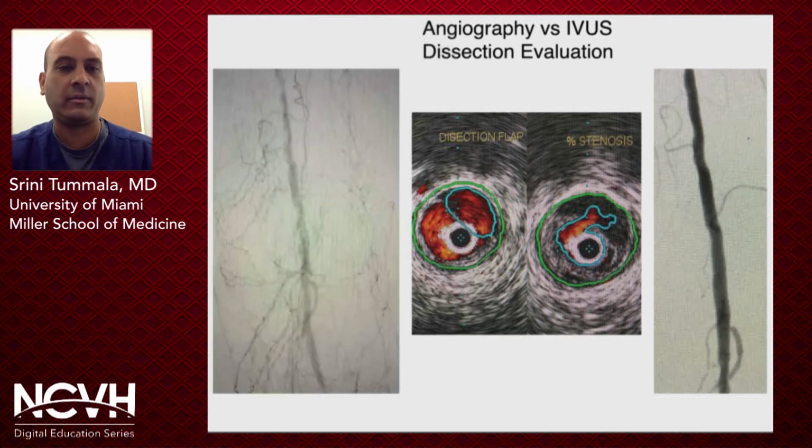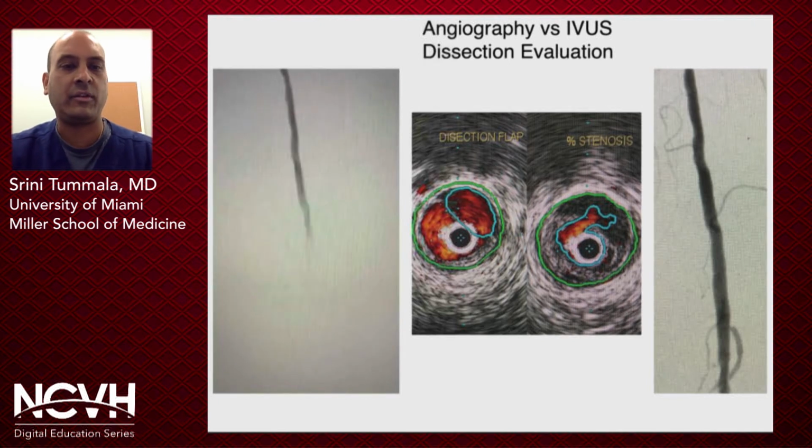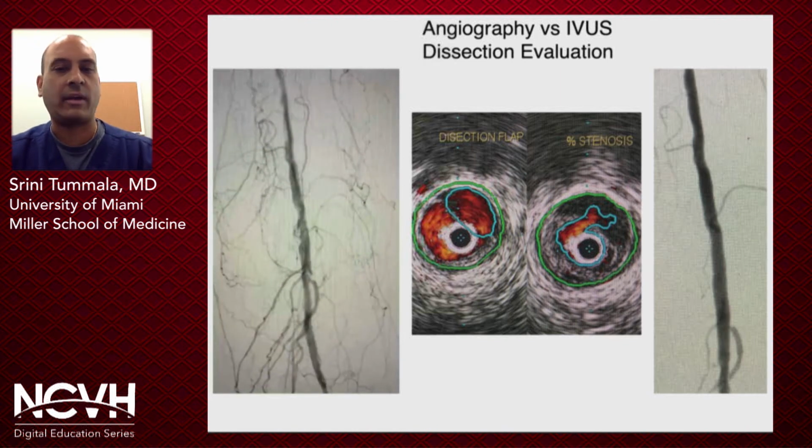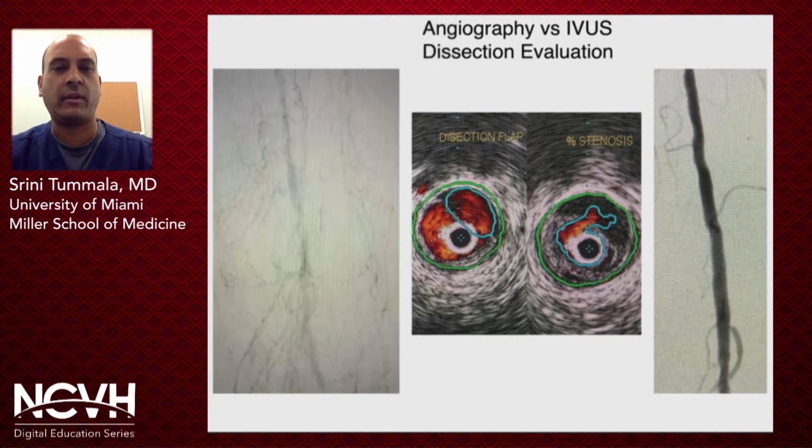The last thing you want to do is leave this alone and then have the patient occlude in a short period of time. And you can see the difference after a stent was placed in terms of the angiographic result, and there was no luminal compromise on post-therapy IVUS.